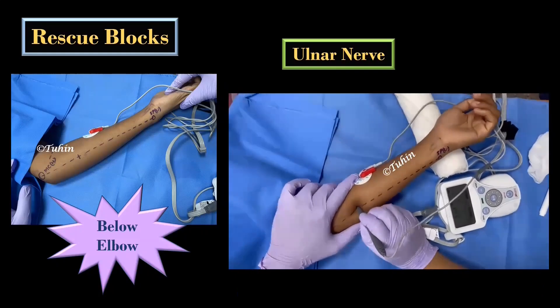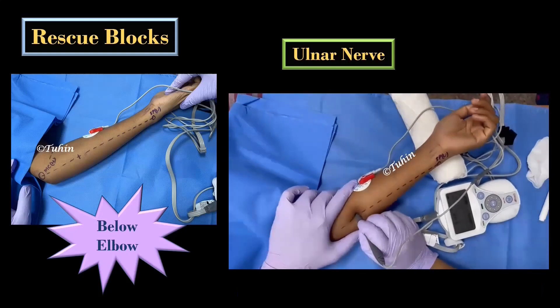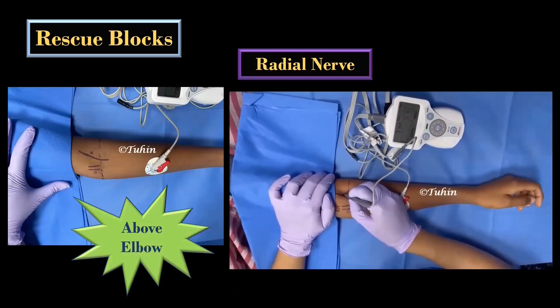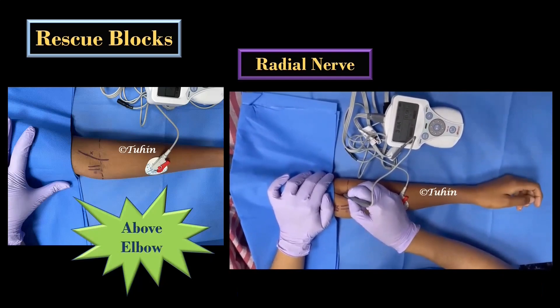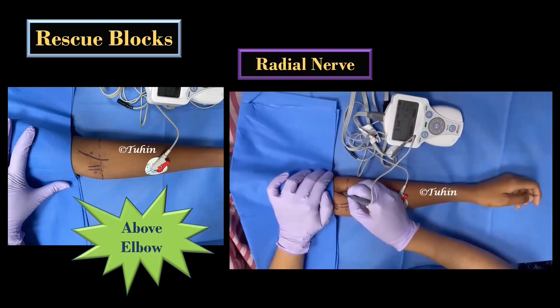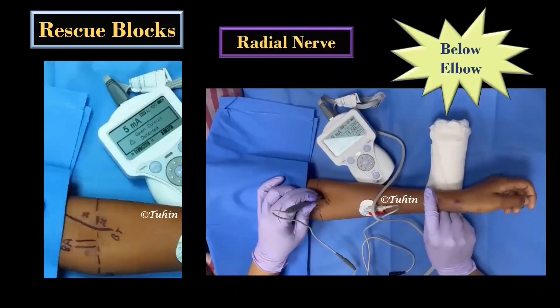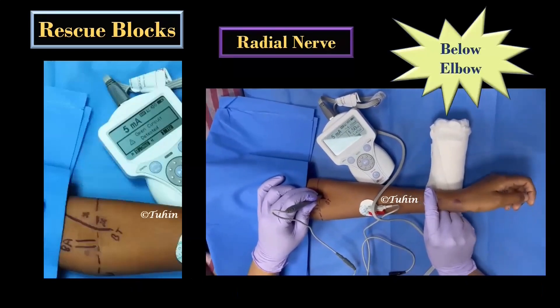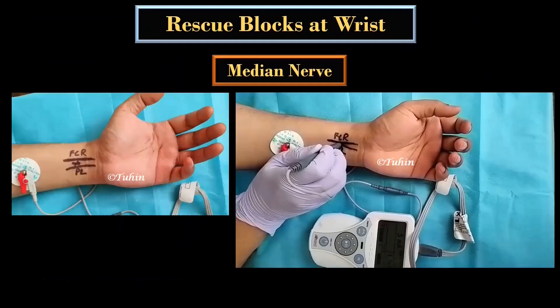Here you will get finger flexion of the little finger and ring finger, and thumb adduction or ulnar deviation of the wrist. For the radial nerve block, the biceps tendon is first identified by flexing the elbow against resistance. A point 1 cm lateral to and above the elbow crease is chosen for needle insertion. Below the elbow, the point will be the same — lateral to the biceps tendon and just below the elbow crease — and here you will get wrist or finger extension.